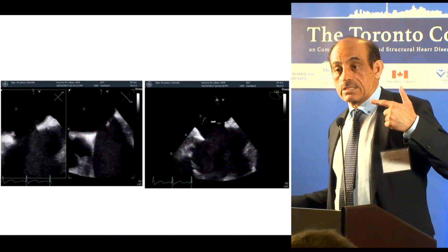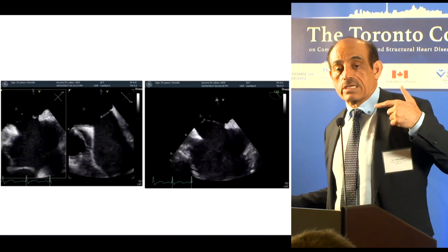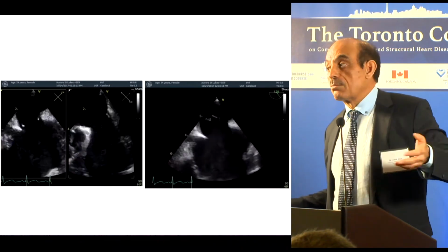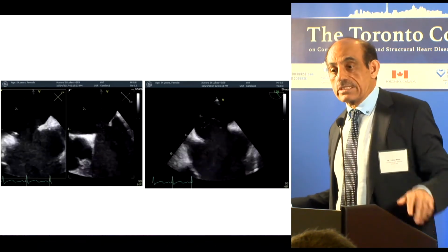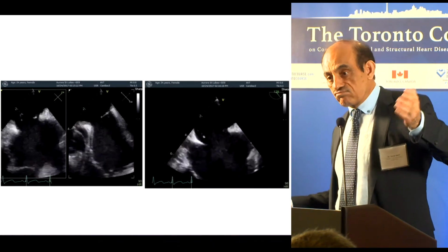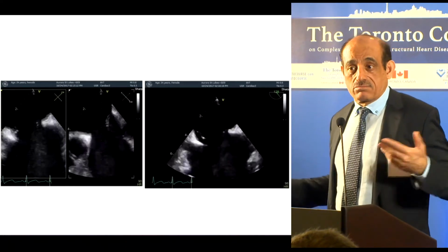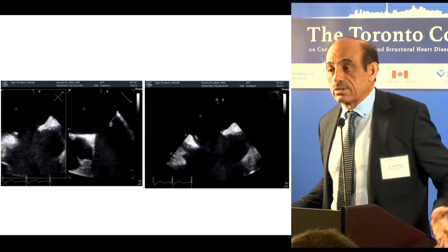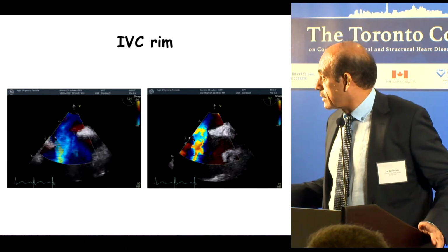This case, just like IVC rim absence, is a case where you can do the case and the device will look pristine, but 6 hours later it will go to the right atrium, right ventricle, and the patient will have PVCs, because the IVC rim is completely absent, the device tilts and goes almost 99% of the time to the right side of the heart. So this is one case I will send to surgery, believe me. You can do it if you want to.